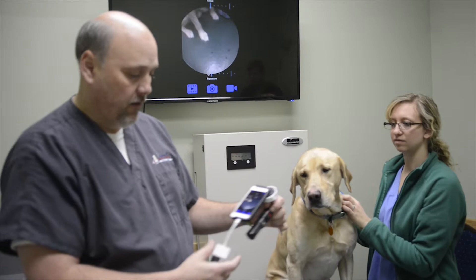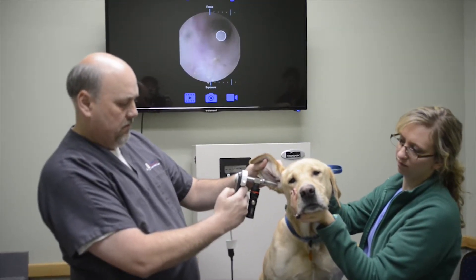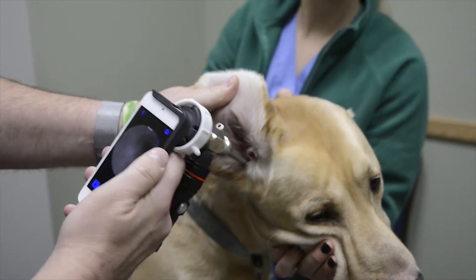You already know how to take pictures and video with a smartphone. The images can be shared with a TV via an HDMI cable. This is a great way to share images with a client during an annual exam.